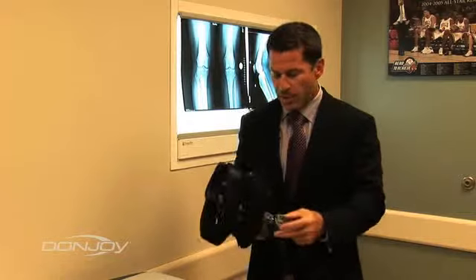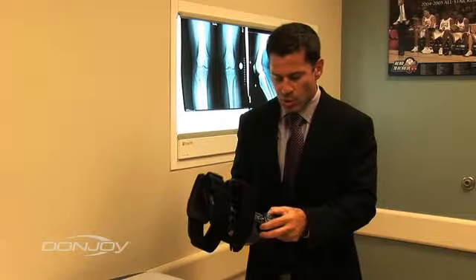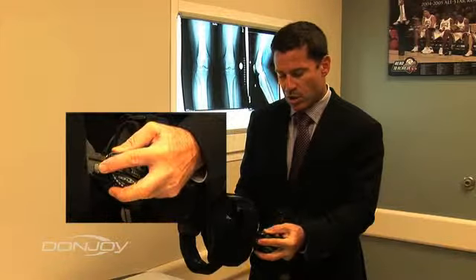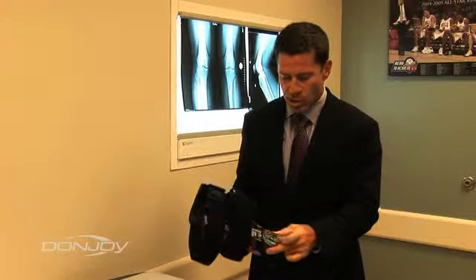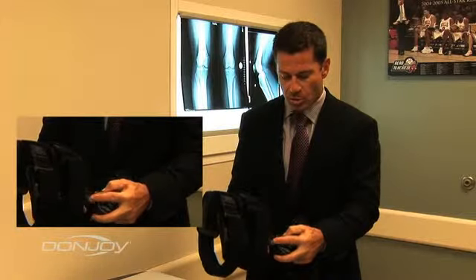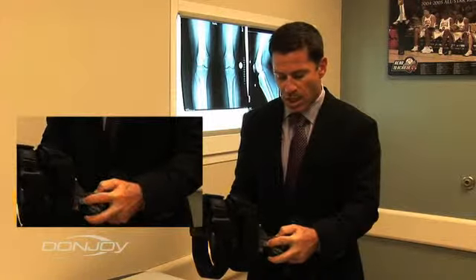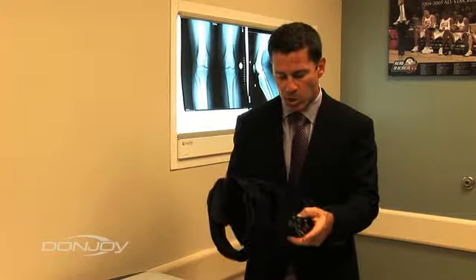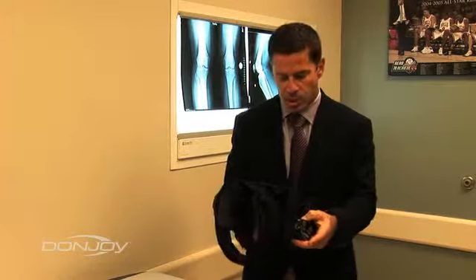So I think about this brace postoperatively just like I used a TROM, and I keep these patients maybe initially in extension. So they may be locked in extension, but I can also control their degree of extension and flexion for the time periods that we begin to unlock the brace. So the brace may remain locked, and then at their first post-op visit I may unlock it. But at this point it's in its neutral loaded position. It's functioning just like a TROM brace.